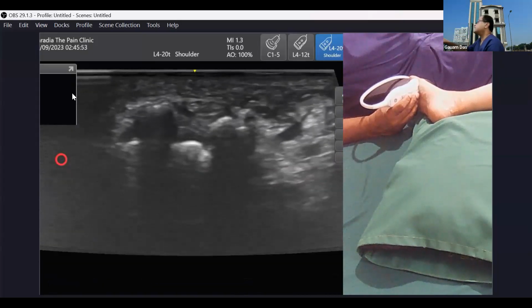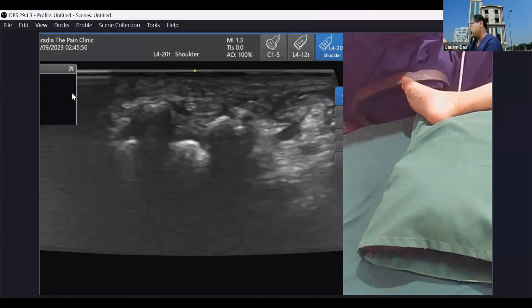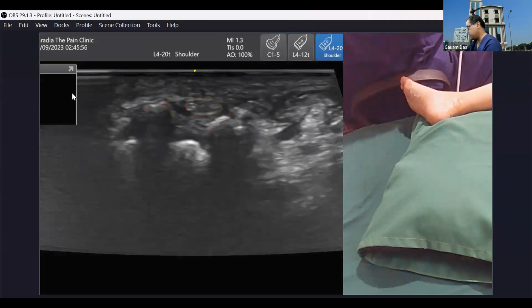So this was, let me draw. So this was one sesamoid, medial side. This is lateral side. This is the flexor hallucis longus tendon. So normally there are two ligaments like this, which are binding and holding the flexor hallucis longus tendon. So sometimes there is inflammation and it can cause pain.